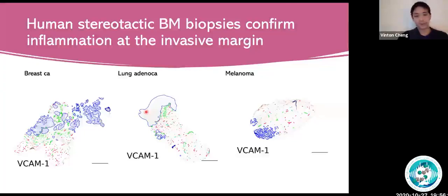And I'll ask the rest of the question really quickly. The other question I had was, why are you not looking at using your imaging agents on SPECT or PET, which I think is something that you're looking at as well? Yes, I don't think we have specifically looked at SPECT or PET, but they definitely can be applied for that. Not the iron oxide particles, they would have to be combined with, for example, a radioactive tracer for PET. But certainly VCAM1, we are looking at different applications, as I said, microbubbles, radionuclide imaging, theranostics.